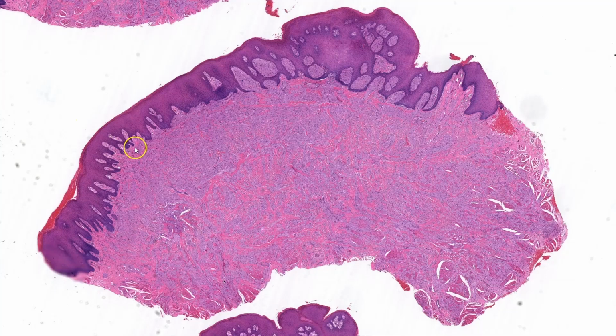I'm also going to note that the area at the bottom right looks a little bit different, and there appears to be clefting around some structure, so I'll make sure to check out that area when we move in closer. At medium power, you'll want to confirm your low power impressions and add more detail regarding the architecture and cytology of the lesion.